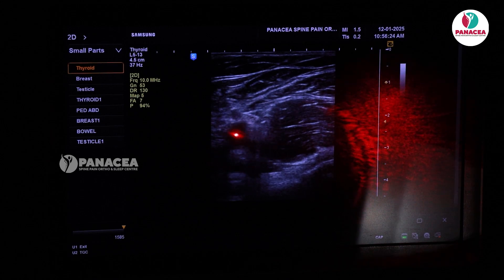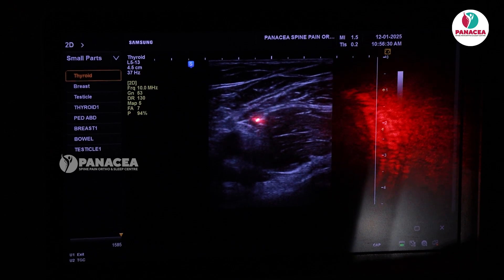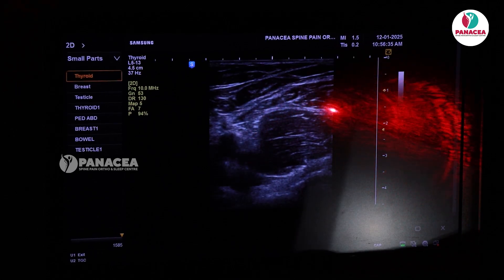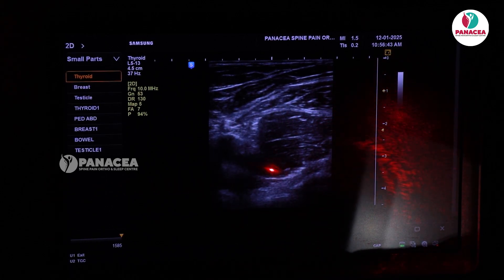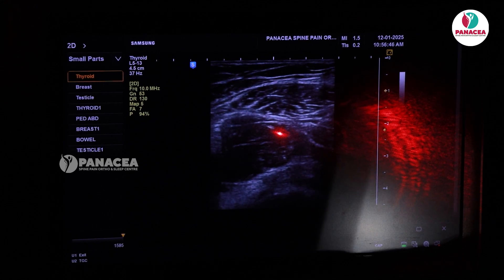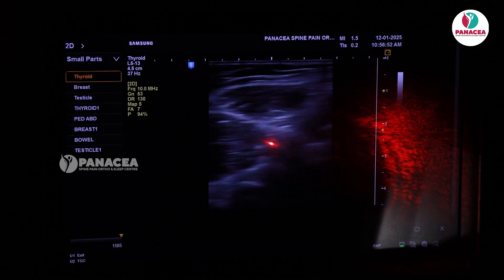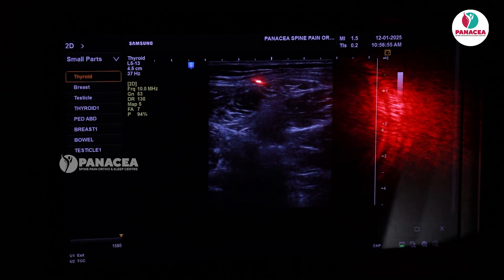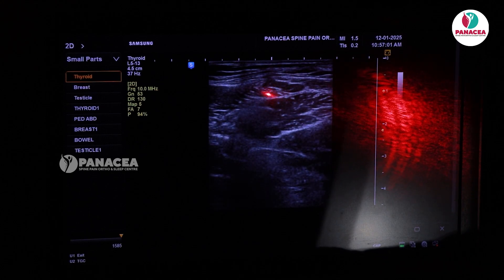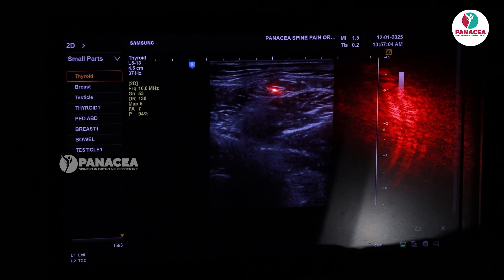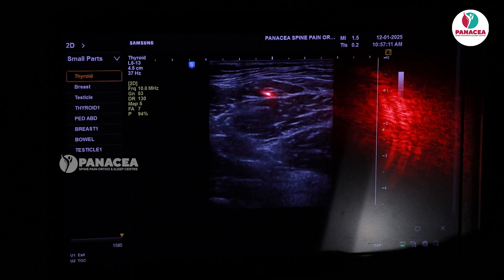On the ultrasound screen: this is the femoral artery — you can see the pulsation — and here is the femoral vein. Here comes the femoral nerve. This is the iliacus muscle — you can see a big iliacus muscle. From middle to lateral: pectineus, psoas, and iliacus. We have placed the probe under the inguinal ligament. Moving laterally, this is the sartorius muscle and this is the tensor fascia latae. You can see the fat-filled flat tunnel between these two. This is the area where we are going to do the LFCN block.